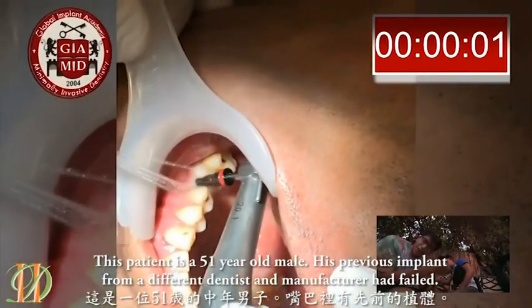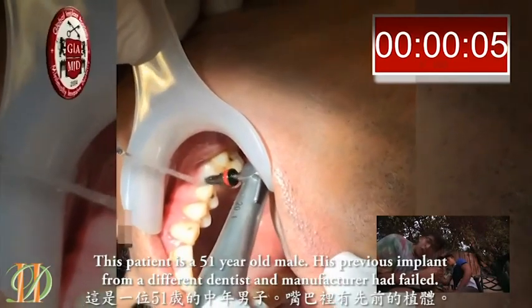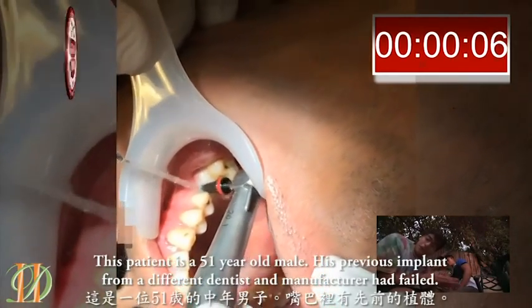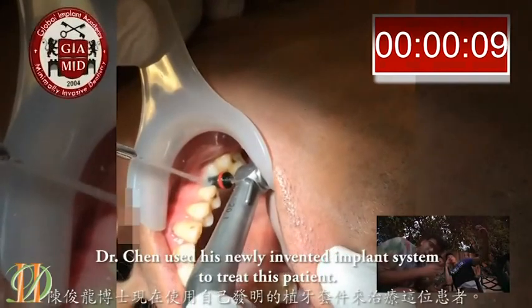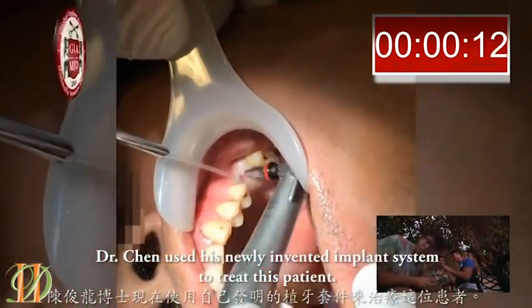This patient is a 51-year-old male. His previous implant was from a different dentist and manufacturer, which failed. Dr. Chen used his newly invented implant system to treat this patient.